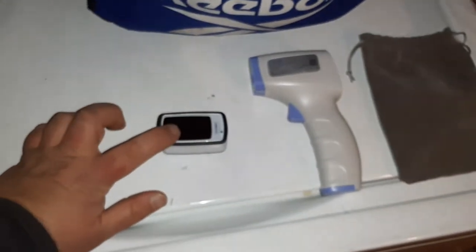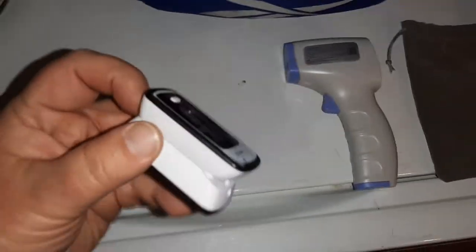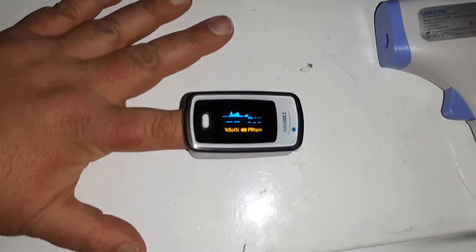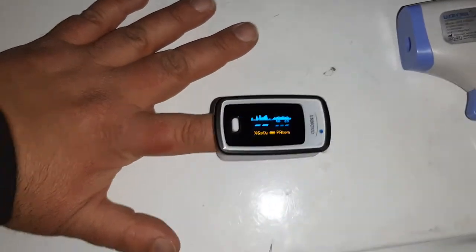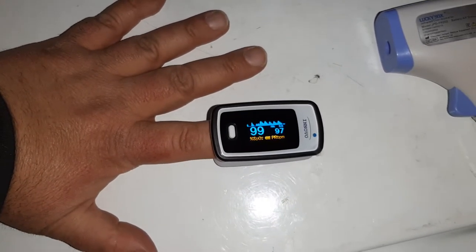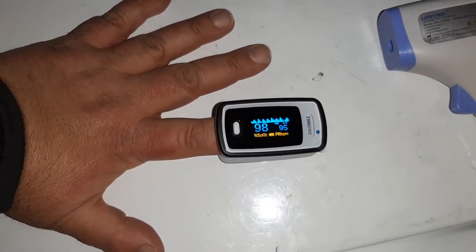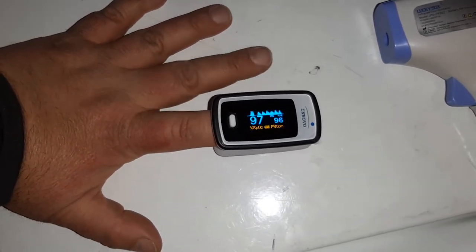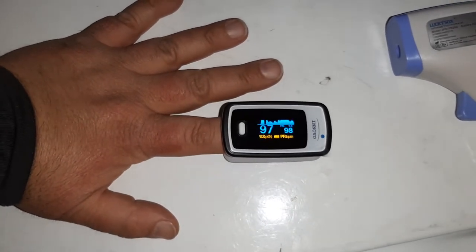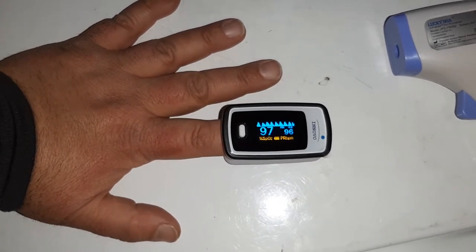The way this thing works is you basically press the white button and it'll start a display. What you do is you put a person's fingertip in there, usually the left index finger. Go ahead and put that on there and it'll start doing its magic. So my oxygen level is 99 and my pulse is 95, as you can see. Left side is oxygen, right side is the pulse. I'm just trying to stay calm for a second so that I can get those nice peaks and valleys up top.